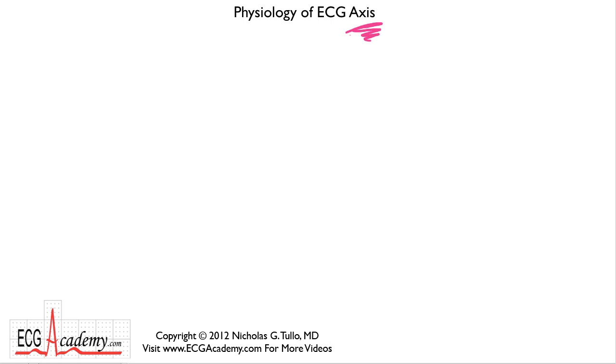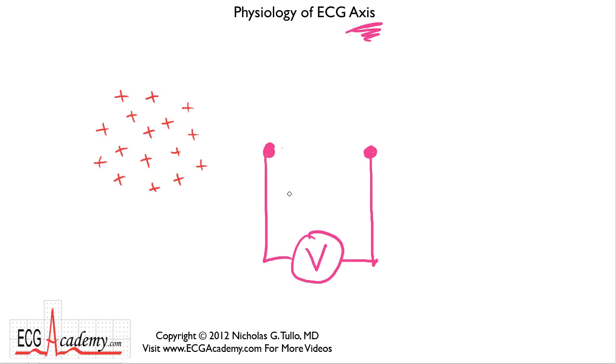So let's get started. Remember, the ECG is basically a recording system to pick up differences in electrical activity between 2 points in space. Well, that would be a bipolar recording system, and the ECG machine is basically a voltmeter. Now, true, some leads are more unipolar, the augmented leads, and we'll talk more about that. But remember, what a bipolar recording system does is it detects differences in electrical potential or voltage across 2 different points in space. So let's say you have this cloud of electrical activity, these electrical charges.